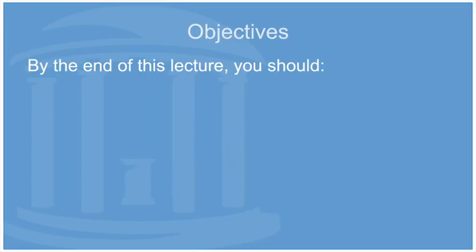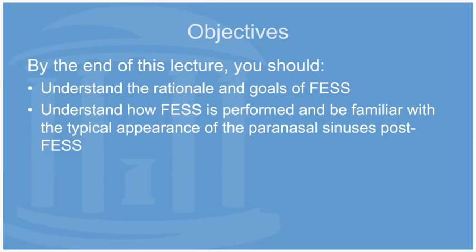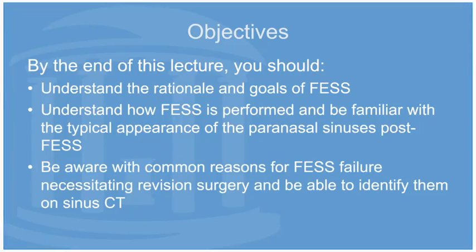So here are our objectives for this talk. By the end of this lecture, you should understand the basic rationale and goals of functional endoscopic sinus surgery, also known as FESS. You should have a general idea of how common FESS procedures are done and be familiar with the expected appearance of the paranasal sinuses post-FESS. And finally, you should be aware of some of the more common causes of FESS failure and be able to identify them on a post-op sinus CT.